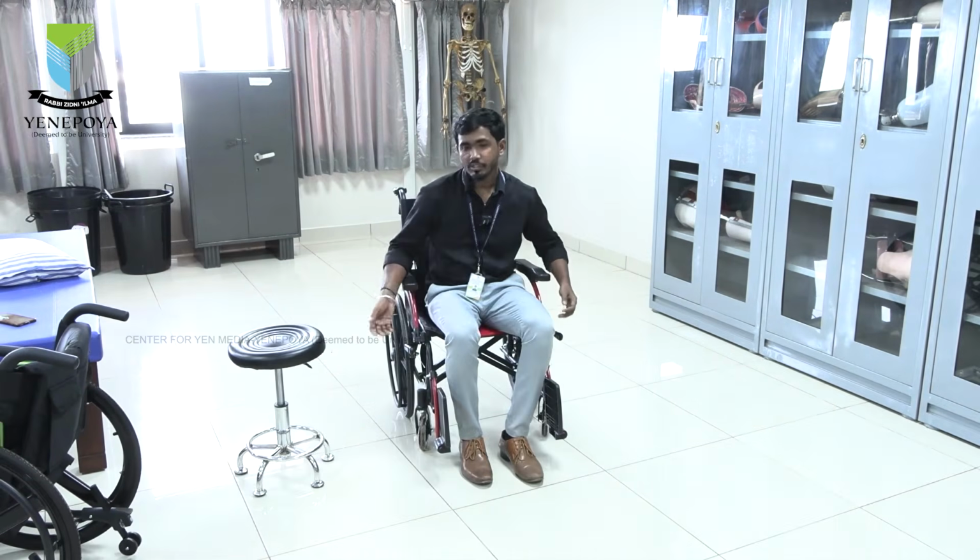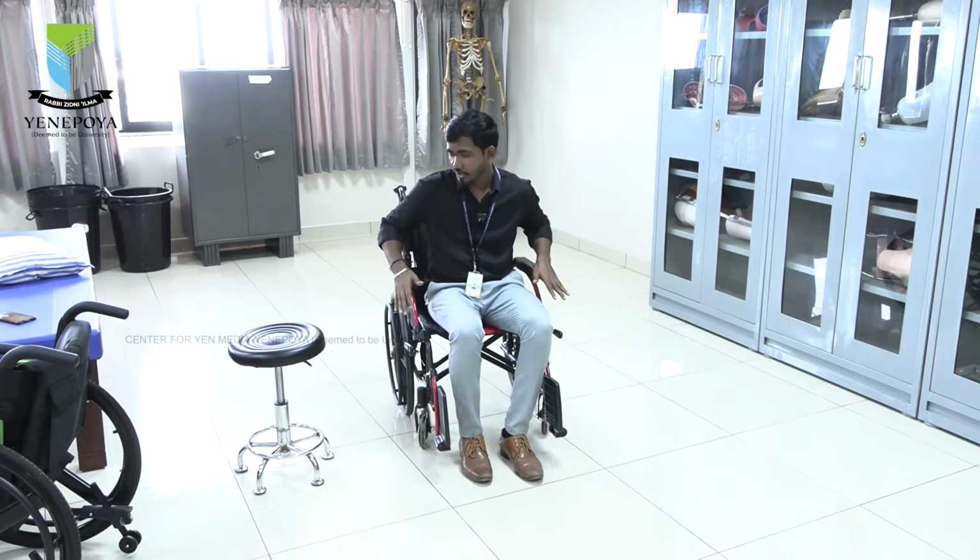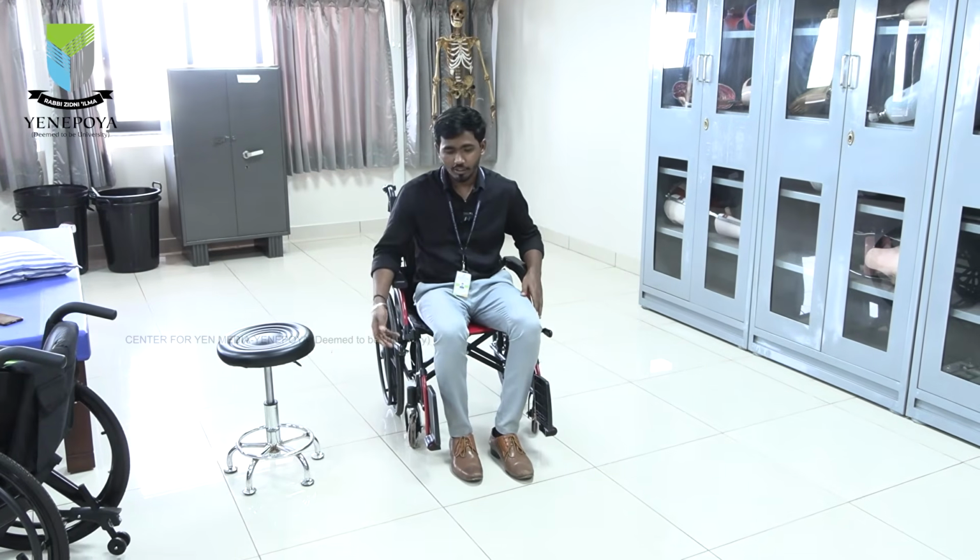This is the easiest method to perform. So previously we have seen the transfers from wheelchair to chair. Now we are going to see how the person can do the ground transfer. So the person wants to sit from wheelchair to ground. So how are we going to do it?